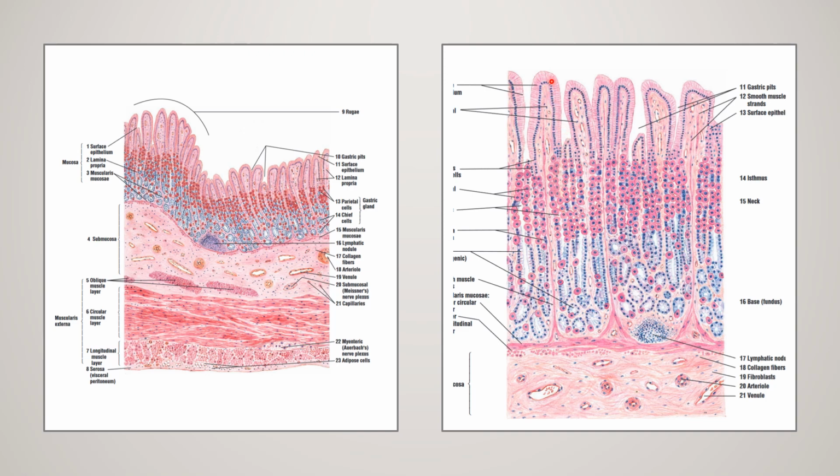You are able to make out that epithelium, gastric pit. Deep to the gastric pit, you are able to make out the gastric glands. These are all the glands. In the glands, what are all the types of cells you have? If you see the upper part of the gland, you have parietal cells. All these parietal cells, otherwise called oxyntic cells, are very important. They are stained with eosin, clearly you are able to make out. They are all pink cells. They are very close to the basement membrane, which gives the beaded appearance. That is the identification point for your fundus.